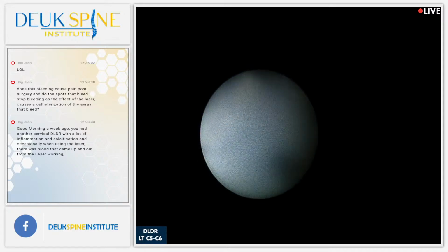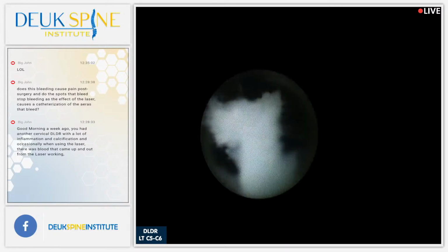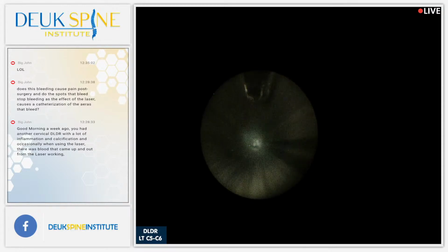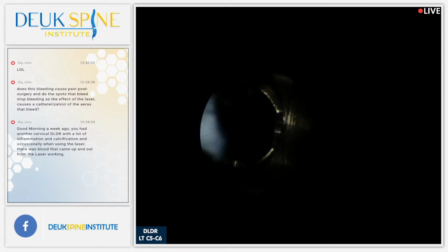All right, these are all pieces of herniation. Now, if you look at his MRI, it doesn't look that bad, right? You can barely see anything. Most doctors would just tell him you got a small herniation. It's not doing anything. You don't need treatment for it. But you do, because it's not going to stop hurting until you get it fixed.